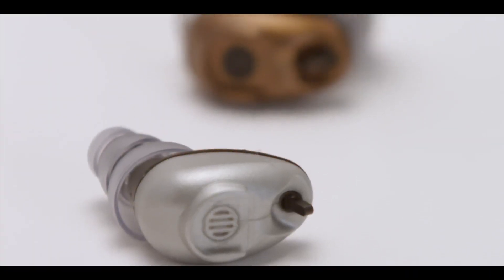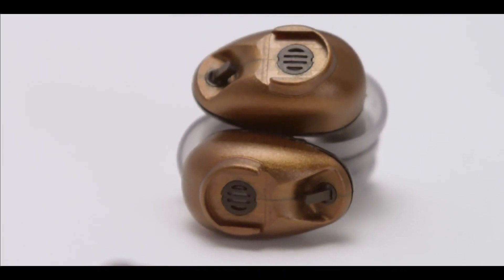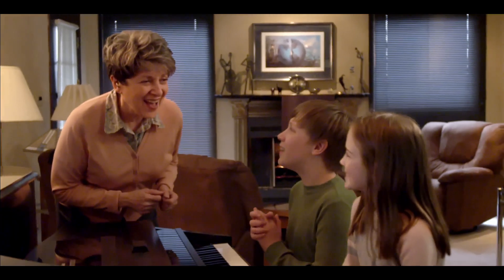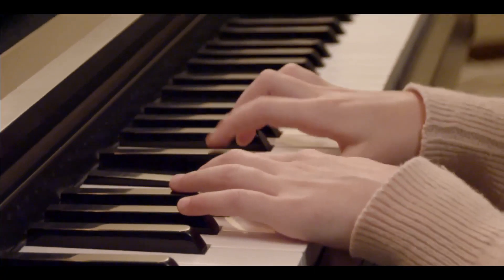A great deal of effort went into ensuring that what you hear with the Bean will be high fidelity and will maximize speech intelligibility. If you're playing or listening to music, the Bean will not distort high-level sounds. This ensures superior audio quality.